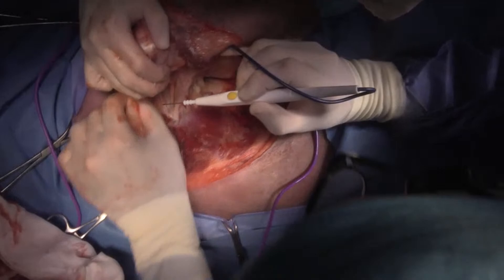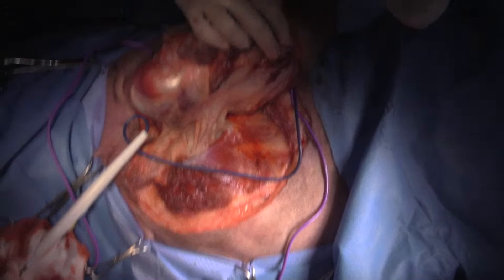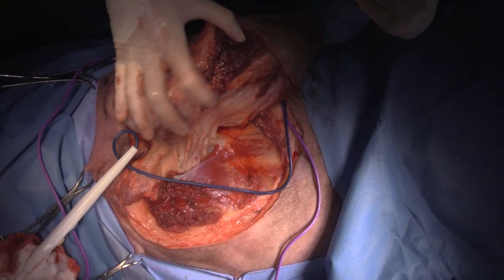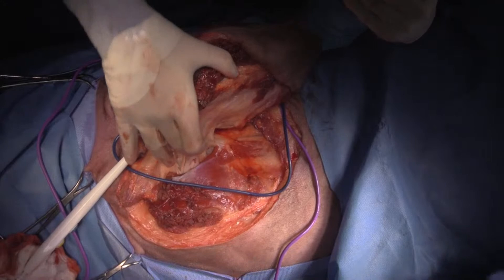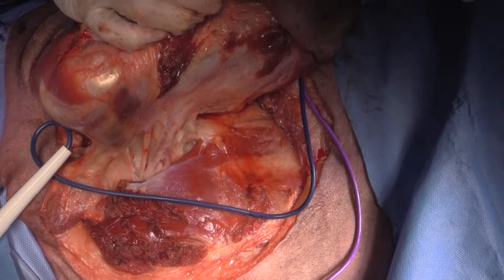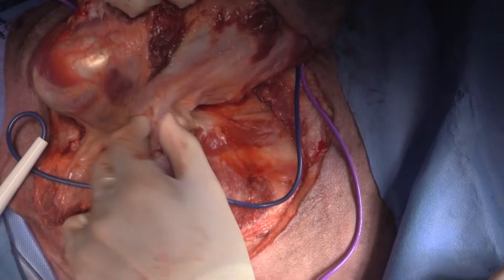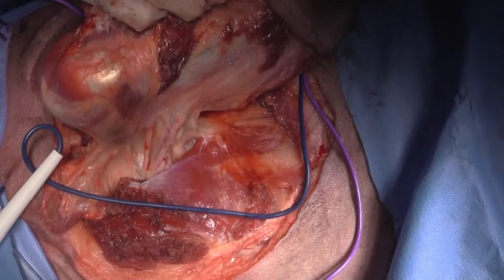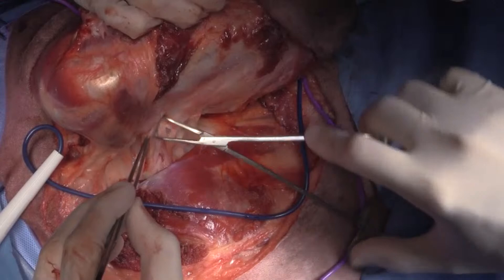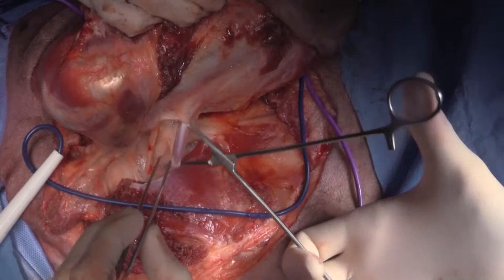Can you guys see that plexus in there? Let me see if I can move this up a little bit and zoom in so you can see. My axillary artery is going to be right in there. So that's the brachial plexus that you're looking at right there. Now we're just going to get in here with a right angle forcep and start separating these out a little bit. There's the axillary artery right there.